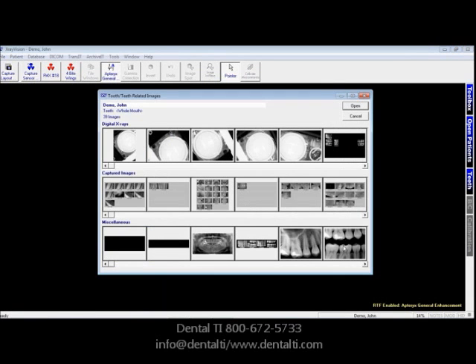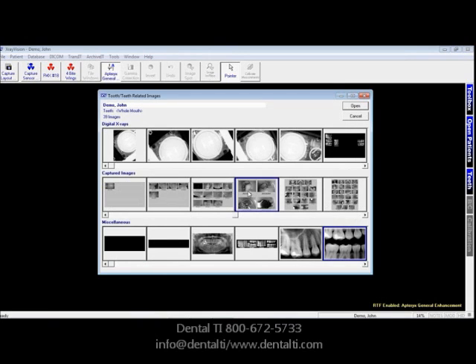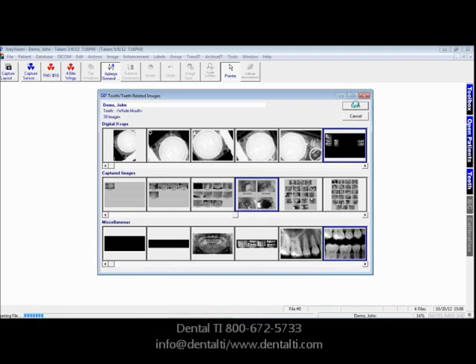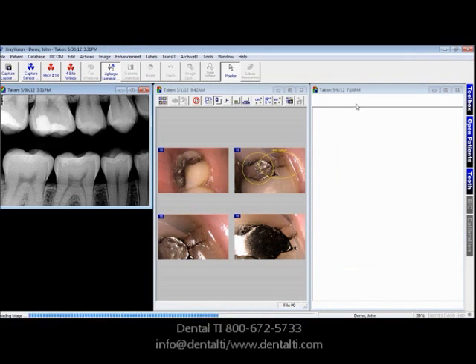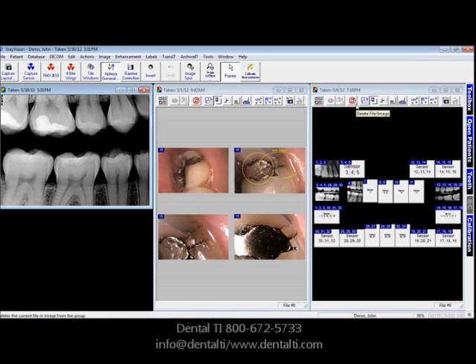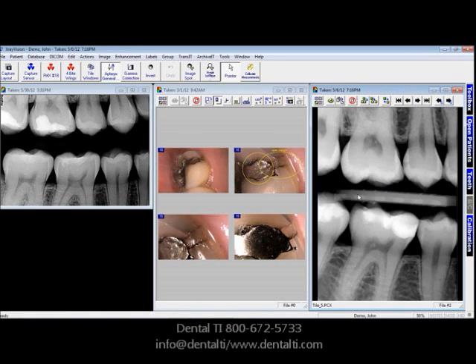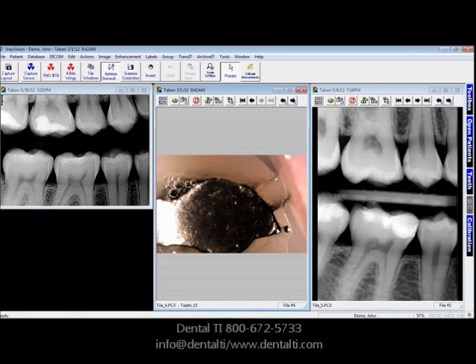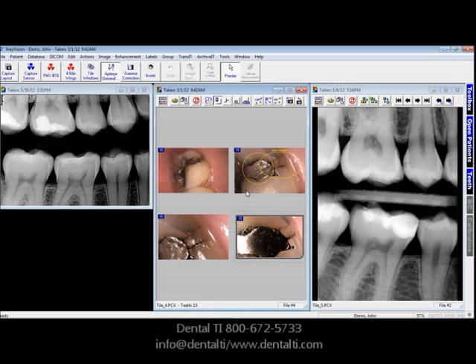We'll do it again with a layout, an individual X-ray, and a series of X-rays. They will be tiled on the desktop where you can see all of the images. You can double-click on the image within the layout to bring it up full view. Double-click again to take it down. That is how you open X-rays in X-Ray Vision.